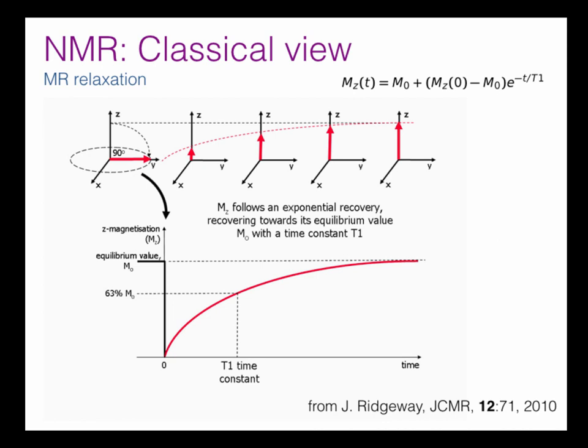Here's another picture of that happening, where you can see the magnetization has been fully excited into the transverse plane, and then over time it recovers, and the MZ component gets longer and longer until it fully recovers here.